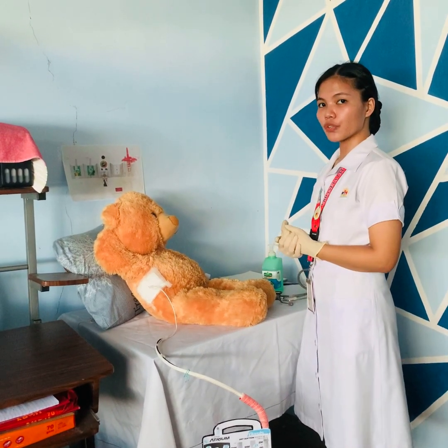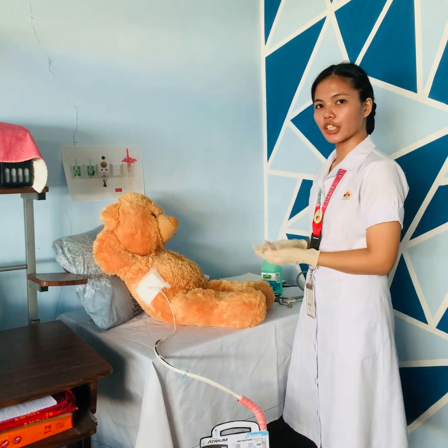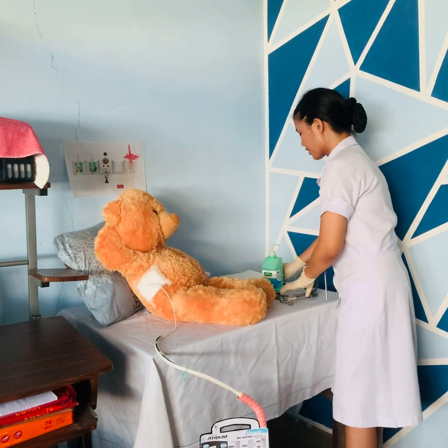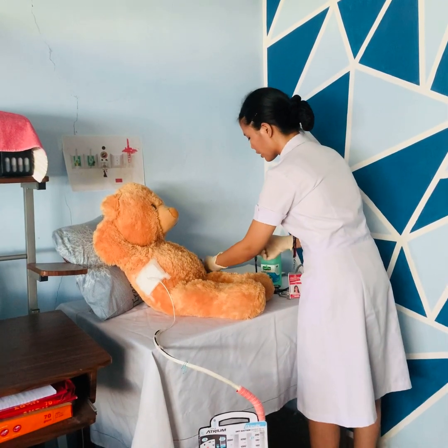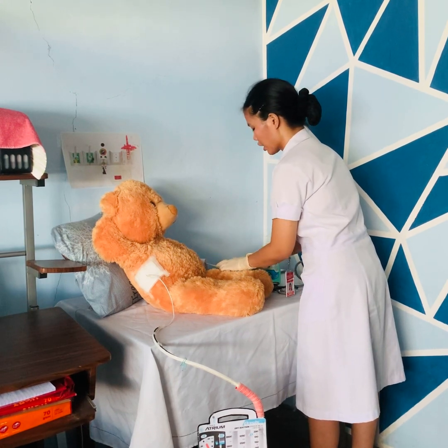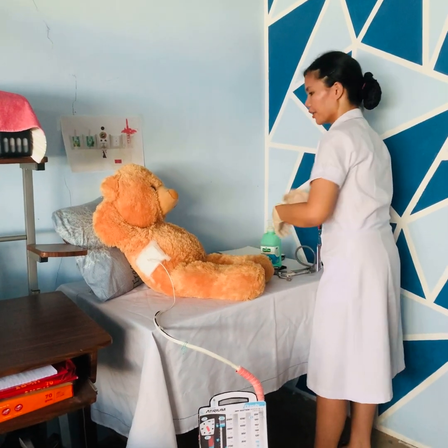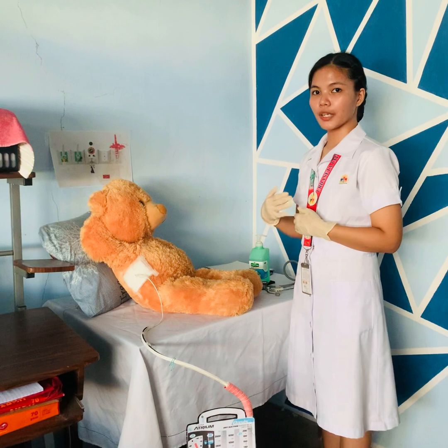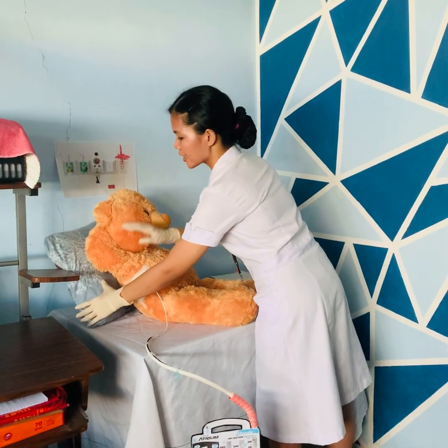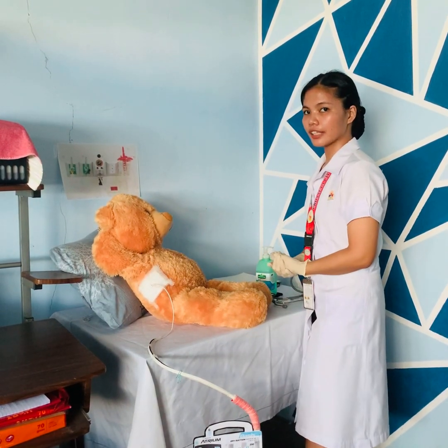Measure vital signs such as blood pressure, temperature, respiratory rate, and pulse rate. Place the pulse oximeter on the patient's finger to check pulse rate and oxygen saturation. Then place the patient in a semi-Fowler position for easier breathing and comfort.